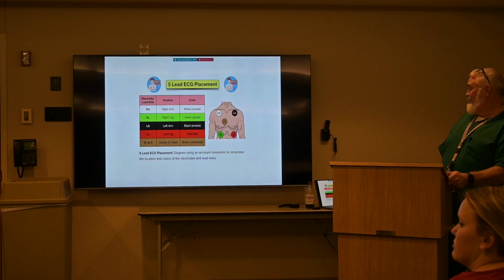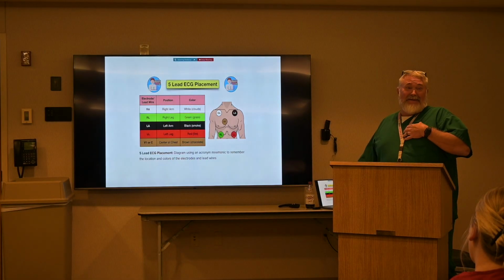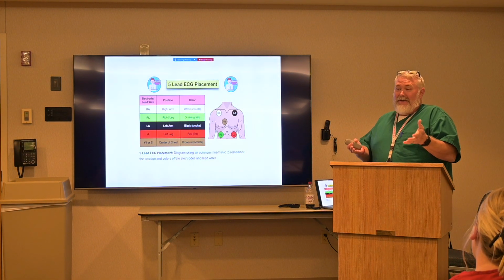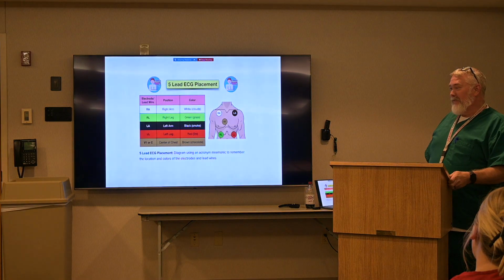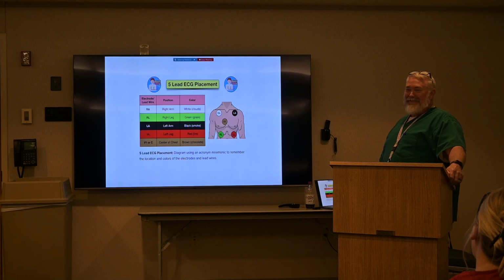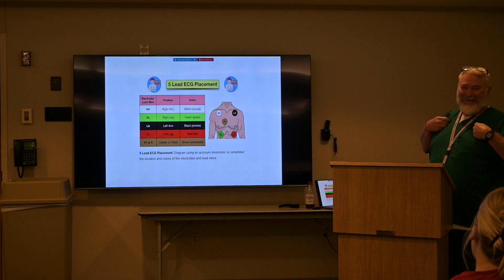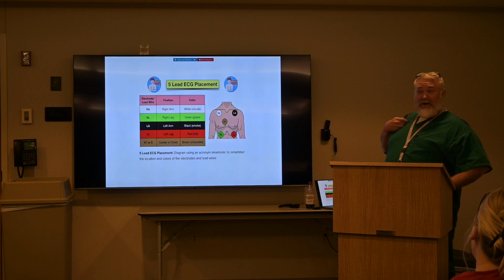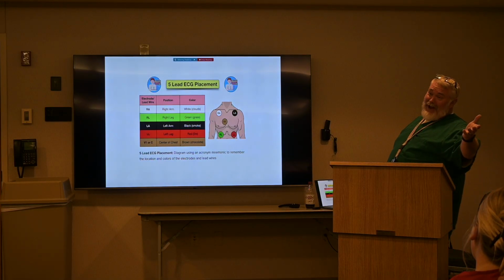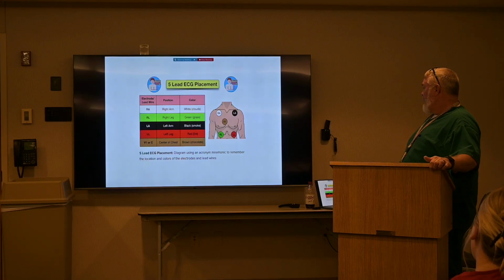Left arm, left lower. I hate to say this, but I've been doing this 30 years now, and if I'm putting leads on, because I still am on Tabor's volunteer ambulance and function as a paramedic still, I have to tell myself as I'm putting the leads on, which is the right? You've got to remember you're looking at it, it's not your right, it's their right.